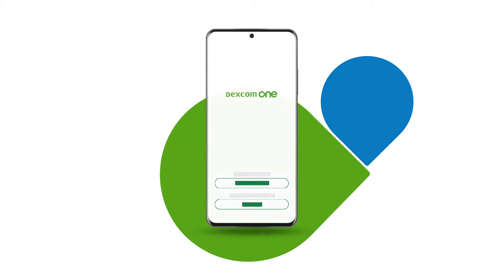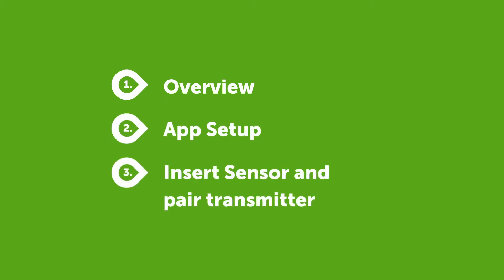The app walks you through the entire setup process, step by step. You will see an overview to learn how Dexcom One works. You will set up connectivity in the app, and you will insert your sensor and pair your transmitter.